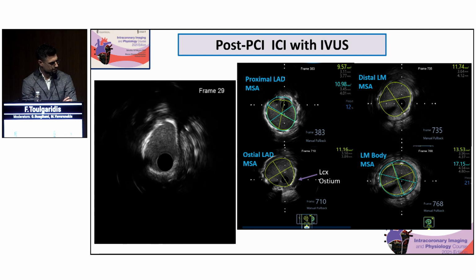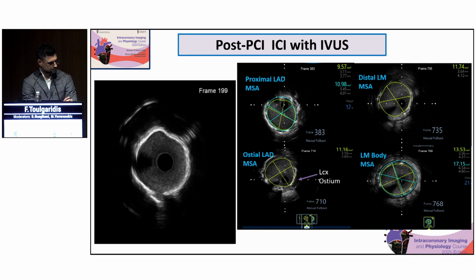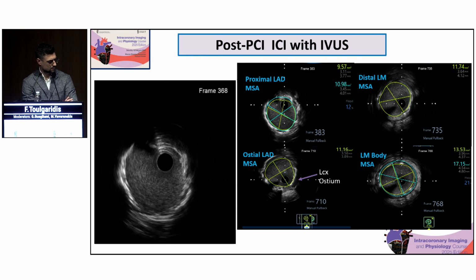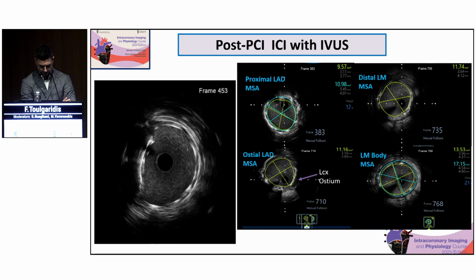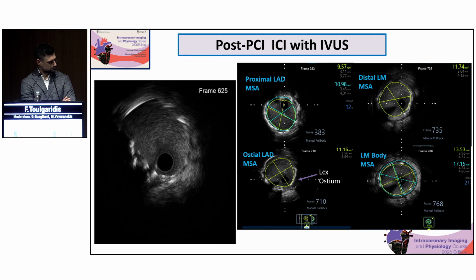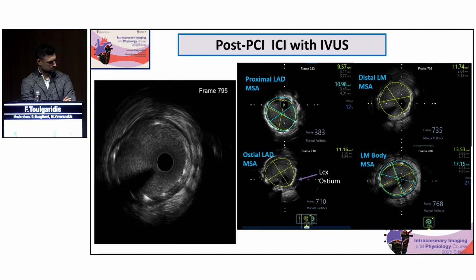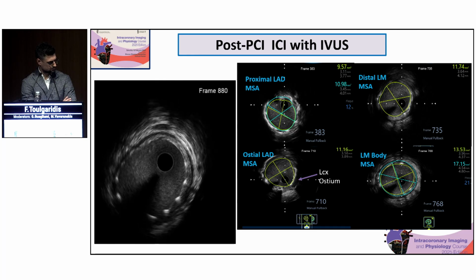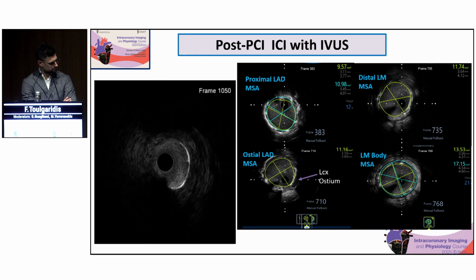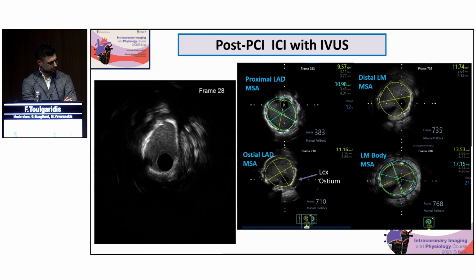One point that I do not understand, when you acquire this imaging, you have also the longitudinal view. And nobody is using the longitudinal view. And if you are dealing with bifurcation, that is dramatically important. You can turn the axis and see clearly, also in IVUS, in the longitudinal view, the bifurcation. People are talking about carina. You can see the carina. So it's very important here, high resolution, precise measurements, how to use for planning and controlling the optimization, but use also the longitudinal view. That is very, very relevant.